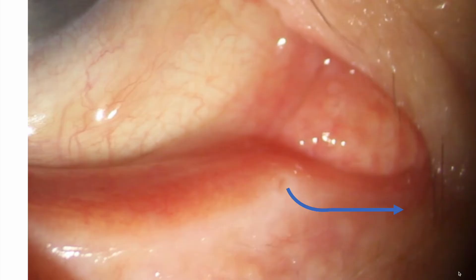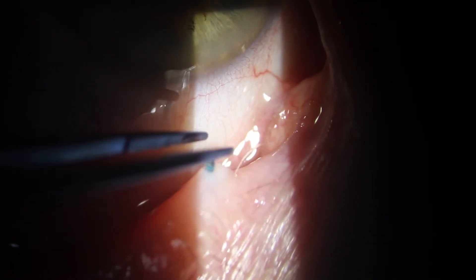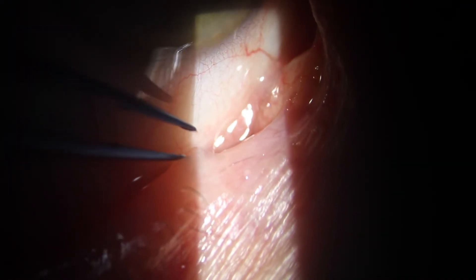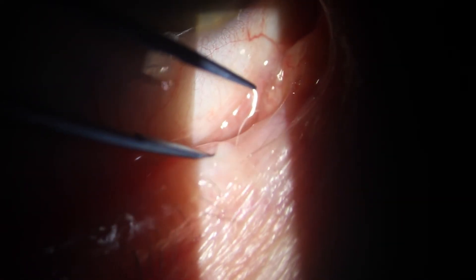You can see that I've done that here. Here you'll see me inserting a lower lid dissolvable plug. These ones are made by Oasis and they last six months. You need some non-toothed fine forceps. They're easy to hold and they're tinted blue to make them easy to see. The patient just has a drop of local anesthetic in their eye — they don't need any more.